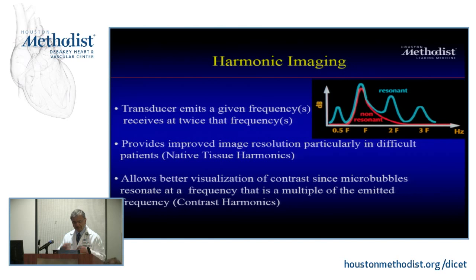Always I do this, and pardon my voices and intonations, but if you're a music player, and most echocardiographers are music players, and if you're not, you should pick it up, as if you're a guitar or a piano player, and if you hit the string, these are string instruments, you hit the string a little harder, right? It has, besides what it emits as frequency, ping, right? It emits multiples of that.